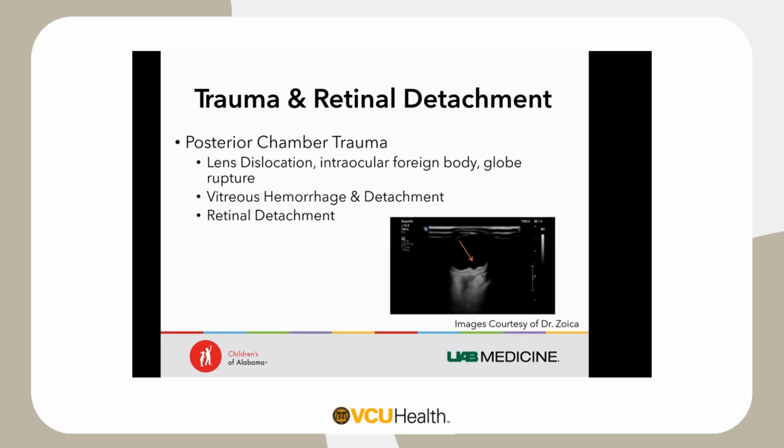And that systematic review also showed that with the retinal and vitreous detachments, the sensitivity and specificity was also still good. It was 0.94 and 0.93 of the low risk of bias, respectively. So I think this shows that even with trauma and retinal detachment, the ocular ultrasound really has a good place, and it is well used by providers who are not ophthalmologists.